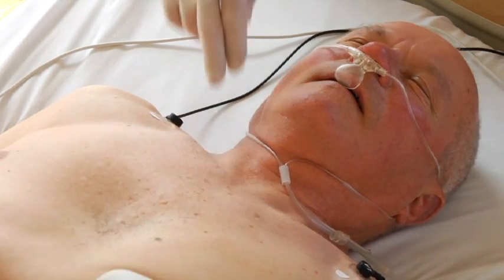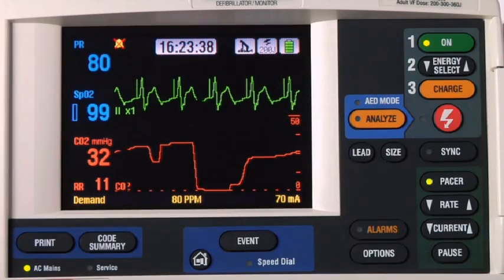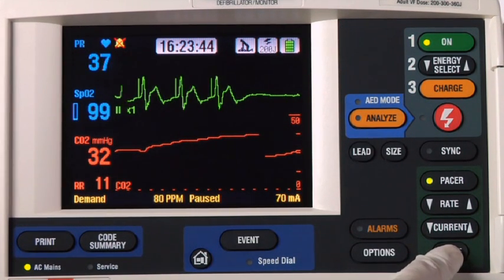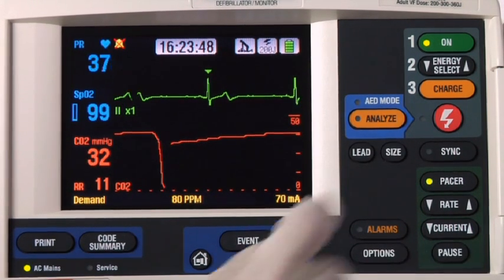It's important to frequently assess the patient for mechanical capture. If you need to check the patient's underlying rhythm, press and hold pause to temporarily reduce the pacing rate. Release the button to resume pacing at the set rate.